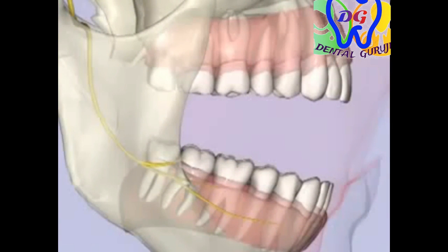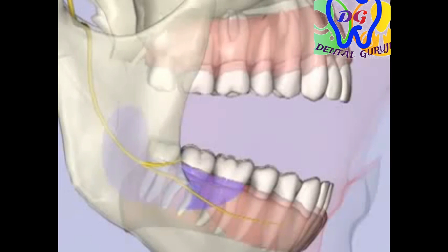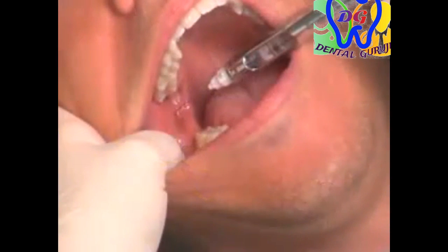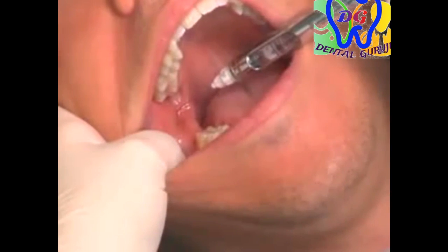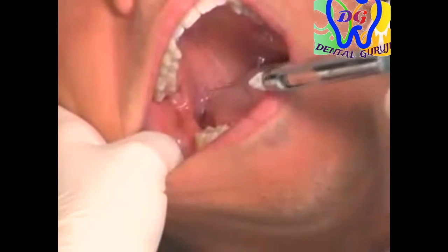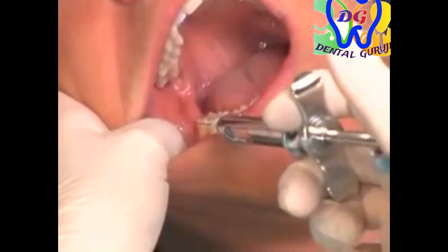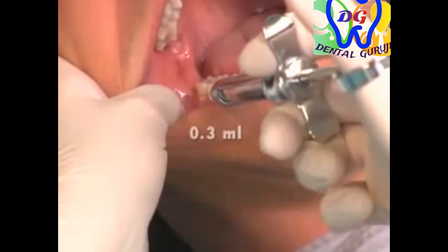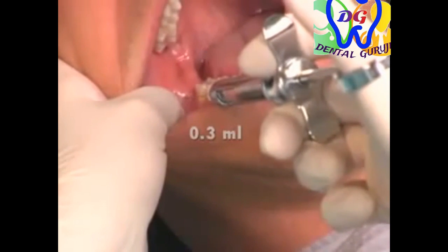The buccal nerve block provides anesthesia to the soft tissue and periosteum on the buccal aspect of the mandibular molars. The injection is given immediately following the inferior alveolar nerve block. A 25-gauge long needle is recommended. The needle is withdrawn, the syringe is repositioned, and the needle reinserted in the mucobuccal fold distal to the last mandibular molar. 0.3 mLs of anesthetic is administered.